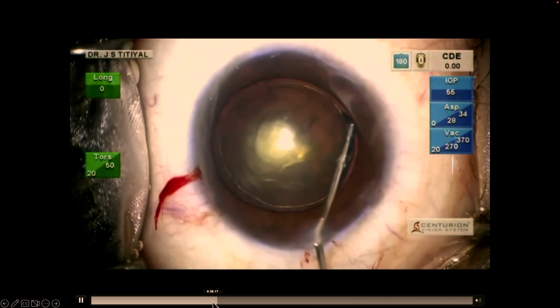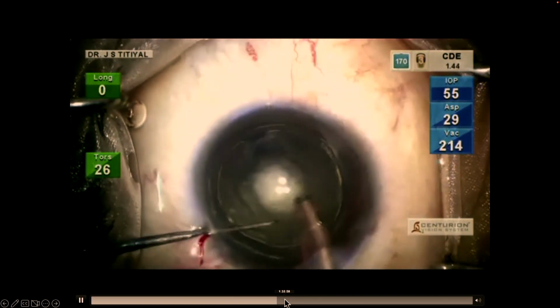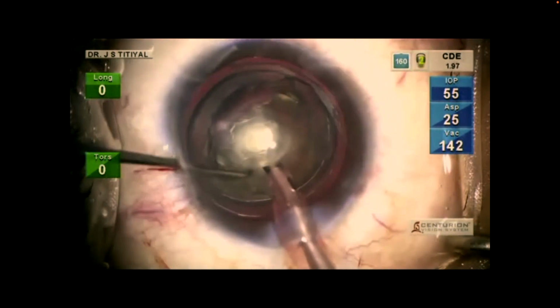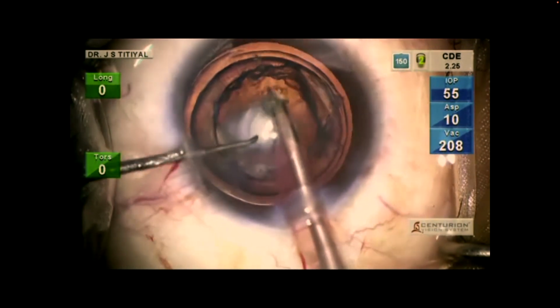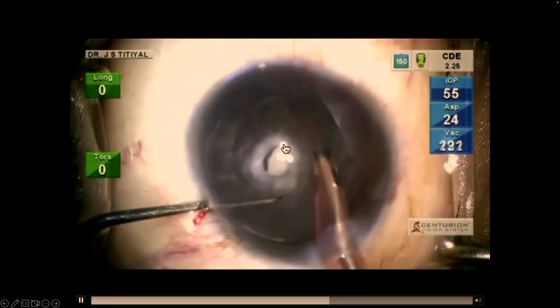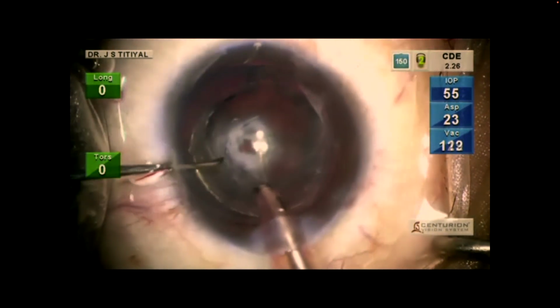Normally, all cases will be softer cataract, which you can delineate very nicely, and emulsification also can be done very clearly. So this is a layer by layer emulsification being done for a case with a softer cataract. Then subsequently take out the endonucleus of the cataract. You are left with the epinucleus core, which you have delineated to safeguard your posterior capsule, and the cortical fiber. So you can see this is the epinuclear cushion. As soon as we take out the epicortex, you can see the defect here in the middle. So sometimes you don't understand, is it exactly a defect in the posterior capsule, or it is just a pseudo defect? It is actually a defect in the epicortical cushion area.